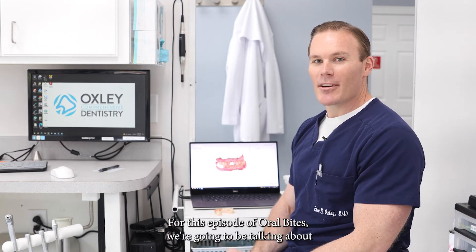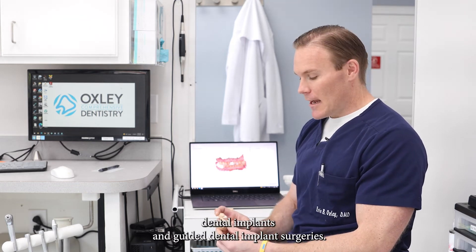For this episode of Oral Bites, we're going to be talking about dental implants and guided dental implant surgeries.